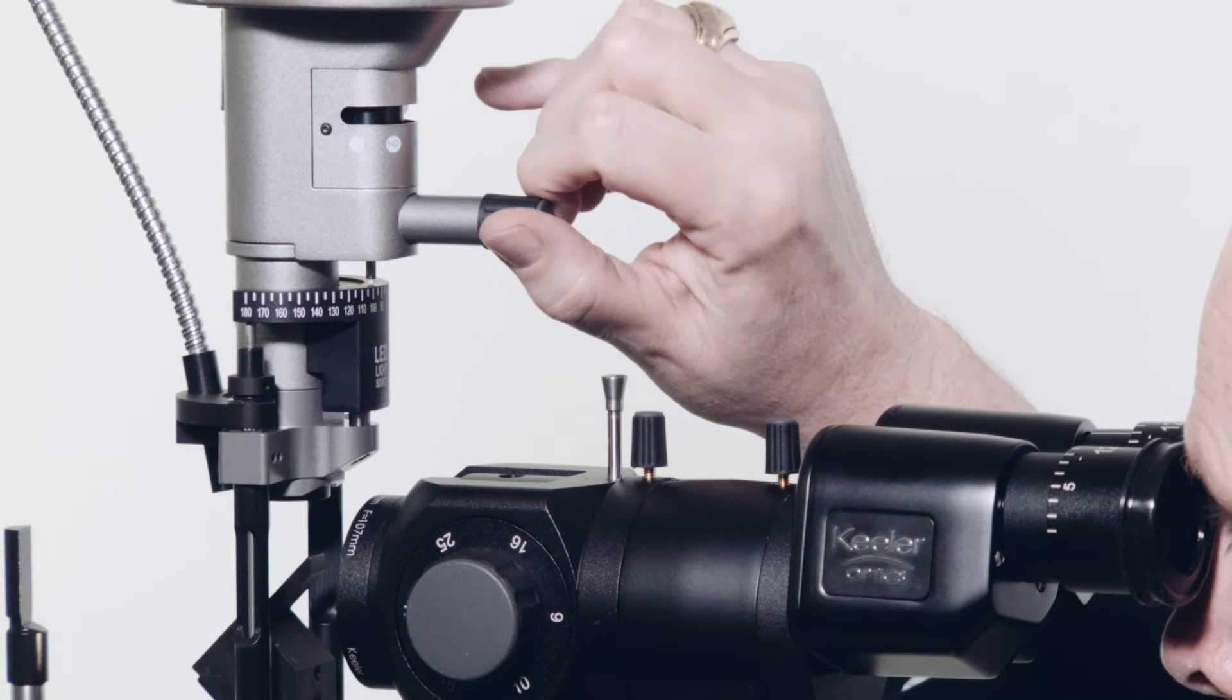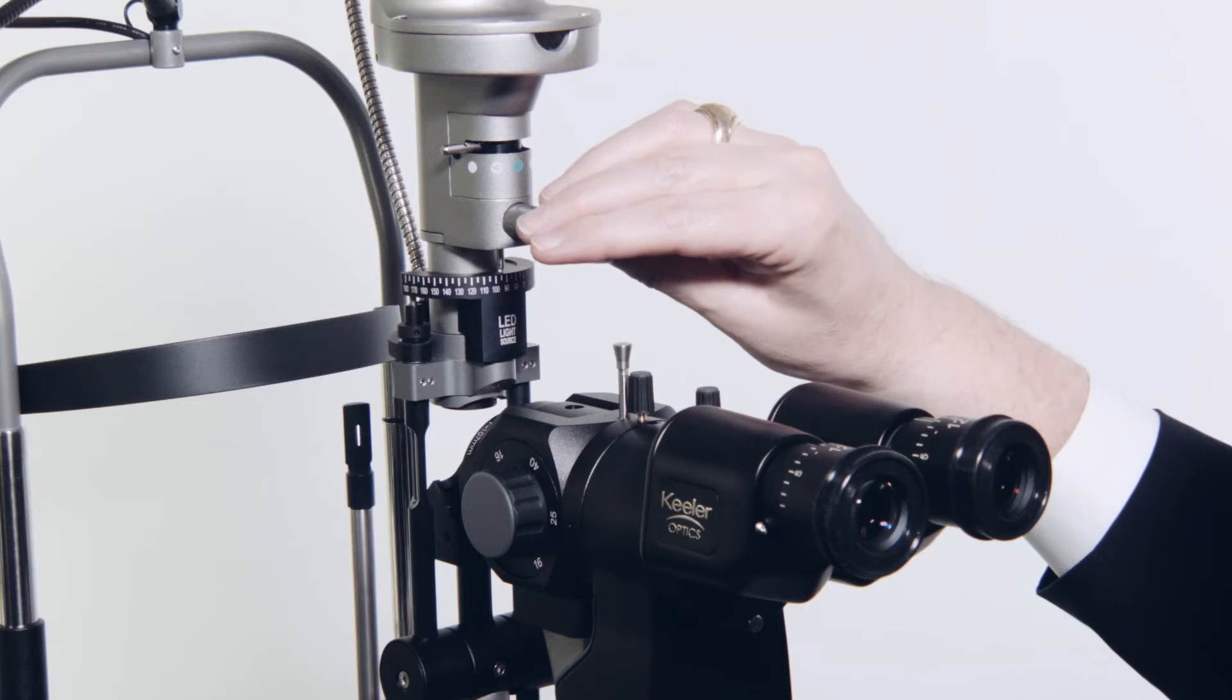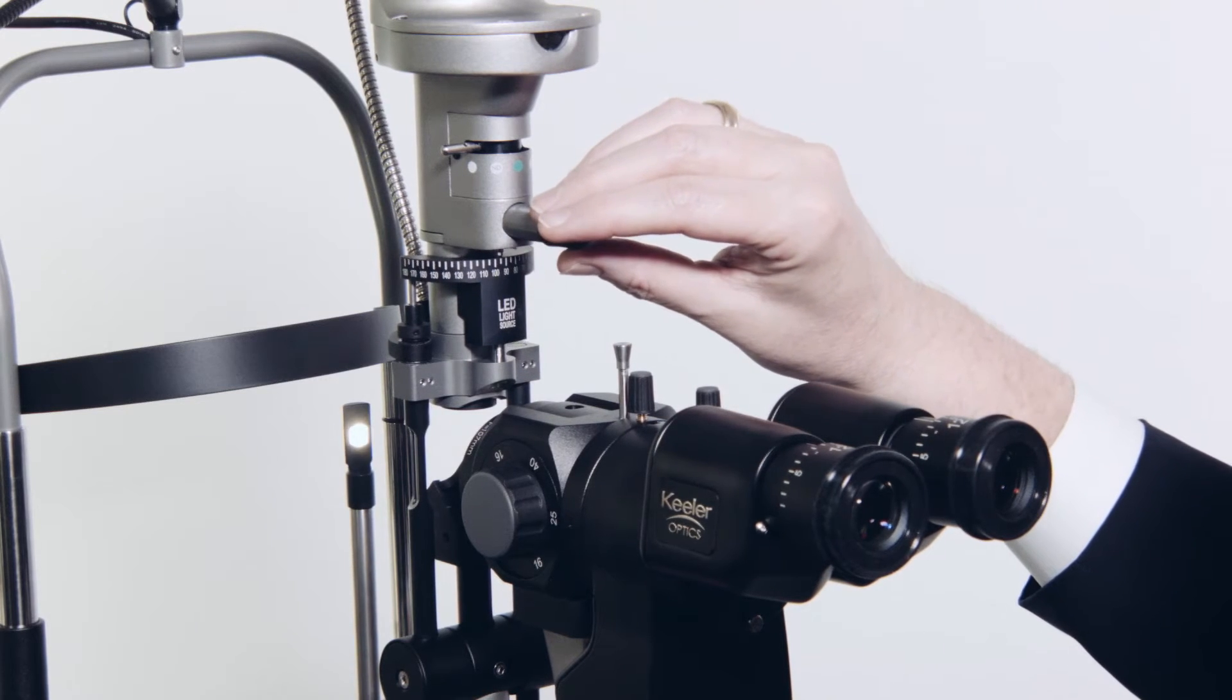Aperture can also be adjusted here. 1mm square aperture can be used for uveitis assessment.